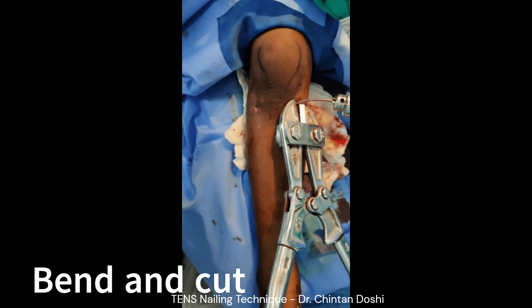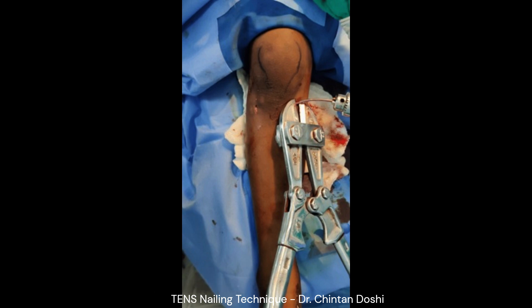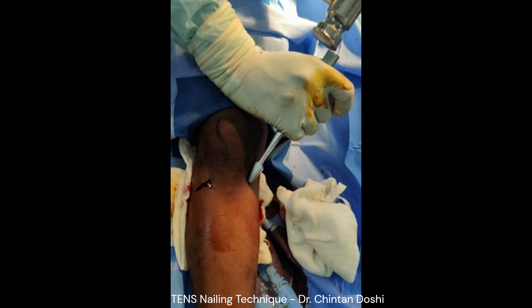The nails are then bent and cut. It is important to cut the nail flush to the cortex to prevent irritation in the post-operative period. The protruding end of the nail under the skin is then gently hammered to remain flush to the cortex of the metaphysis.